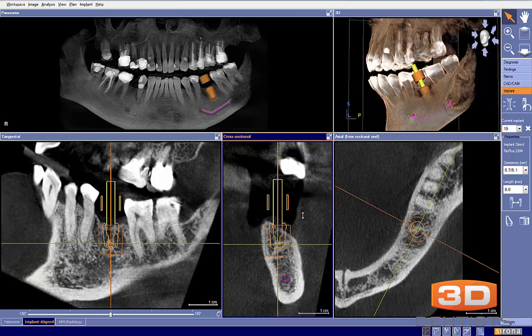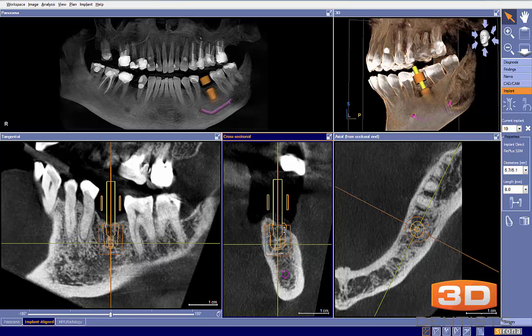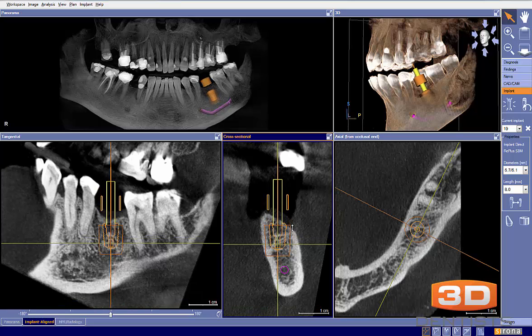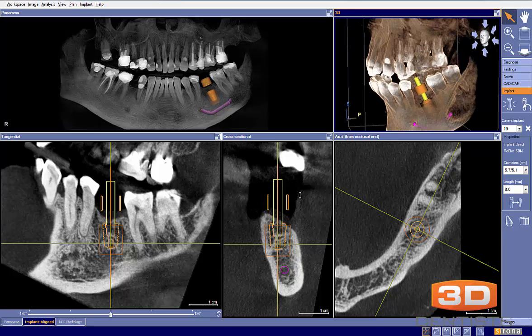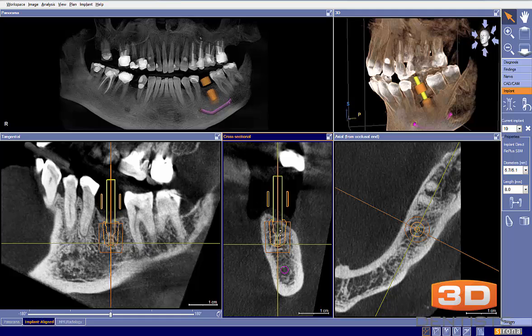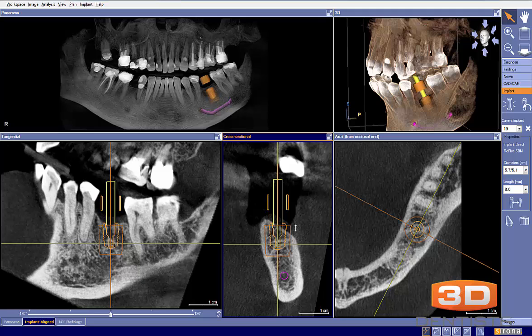One of the things that would determine where I place this implant, if I do place it this low, would be the addition of some CEREC data to see where our virtual margin would be, and then to use our design to determine the apical placement. My gut tells me I'd probably want this implant to be somewhere right here. So for the time being, let's leave it and keep moving on past bone level.